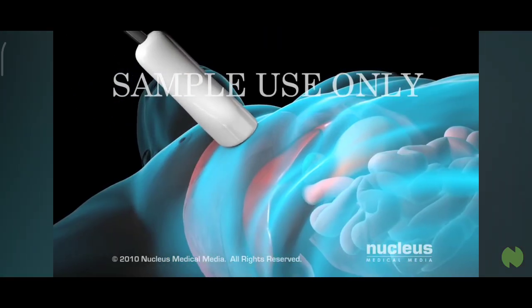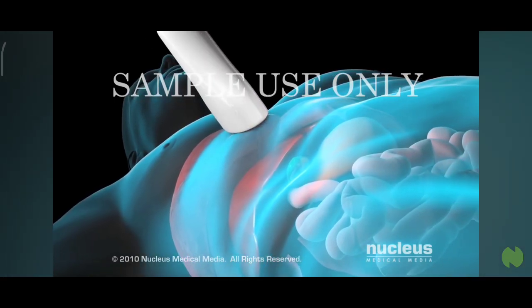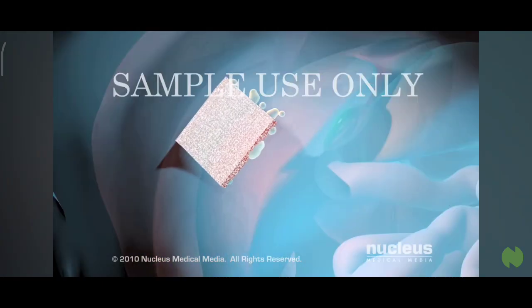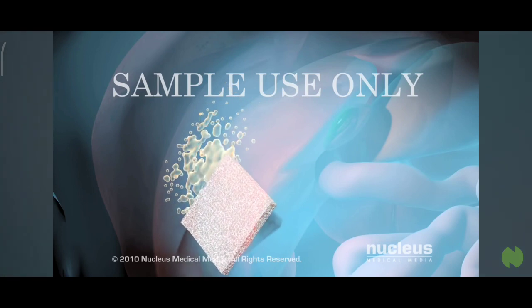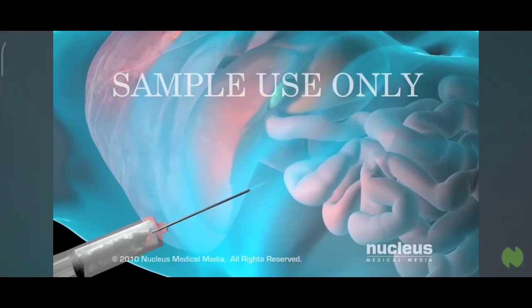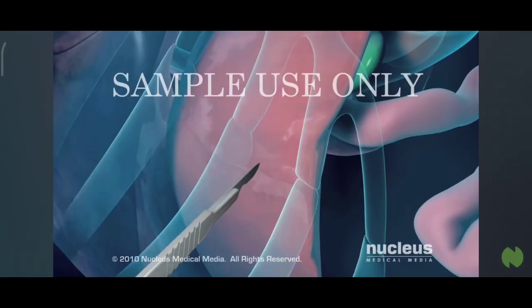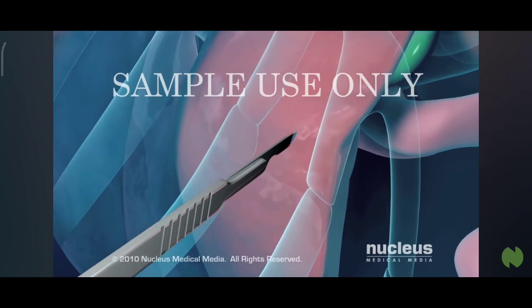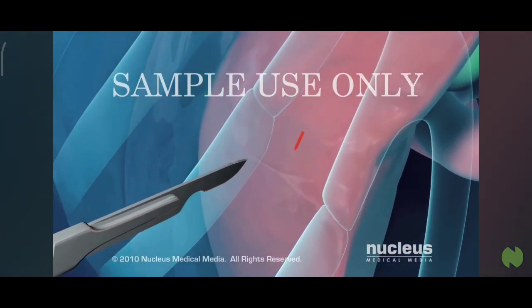Your doctor will determine the location of your liver by ultrasound or by lightly tapping your abdomen with his or her fingertips. After cleaning the area over the biopsy site with an antiseptic, your doctor will inject a local anesthetic to numb the skin and surface of the liver. Once the skin is numb, your doctor will make a small nick with a surgical blade. This is where the needle will be introduced.